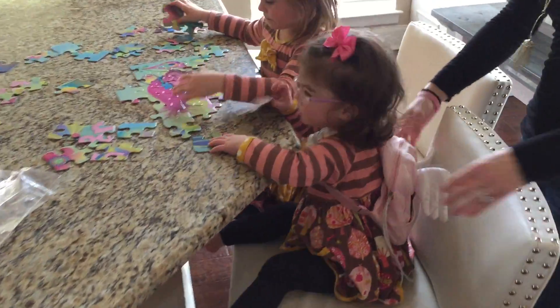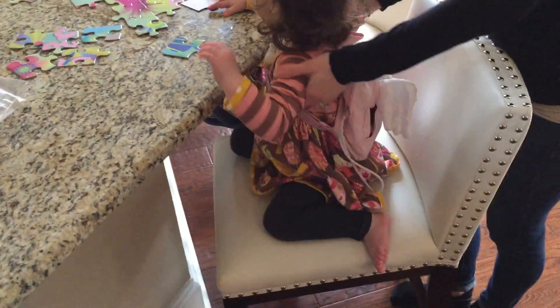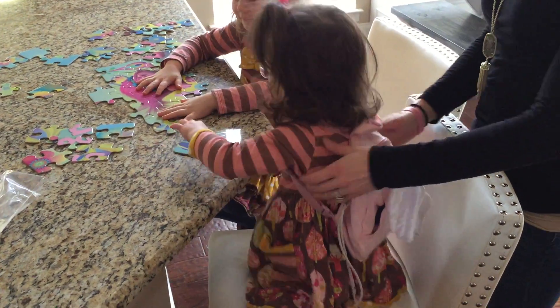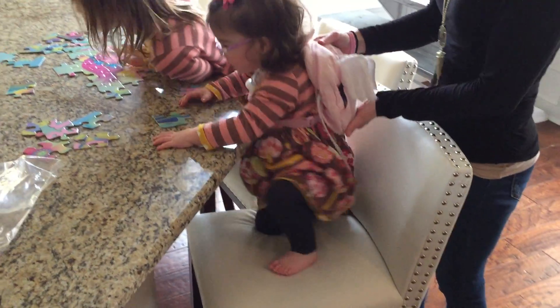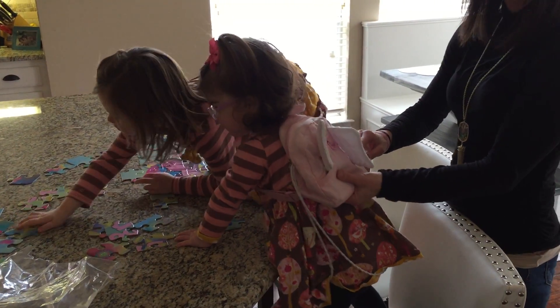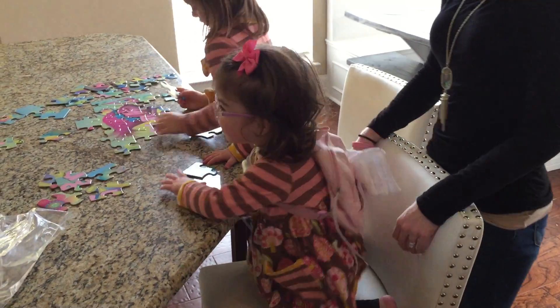Now with her little backpack on, she's completely 100% mobile — independent, free. She gets to come up here with big sister, do puzzles, and just run around like a normal kiddo. She just has a little backpack on. This unit doesn't weigh that much — maybe a pound, pound and a half. It runs on nine-volt batteries and we change them every 15 days, just twice a month.